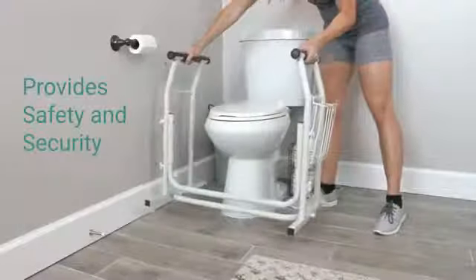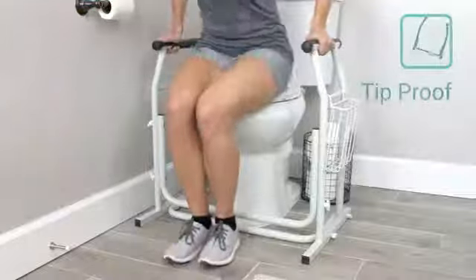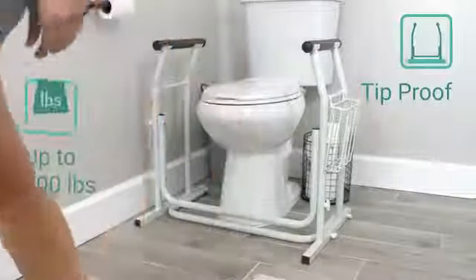The stand-alone toilet rail by Vive ensures safety and security in the restroom. The durable frame provides tip-proof stability and supports up to 300 pounds.